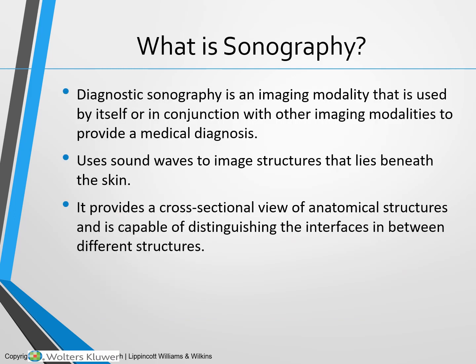Diagnostic sonography is an imaging modality that is used by itself or in conjunction with other imaging modalities such as CT, X-ray, or MRI to provide a medical diagnosis. Ultrasound uses sound waves to image structures that lie beneath the skin, and it provides a cross-sectional view of anatomical structures and is capable of distinguishing the interfaces between the different structures.